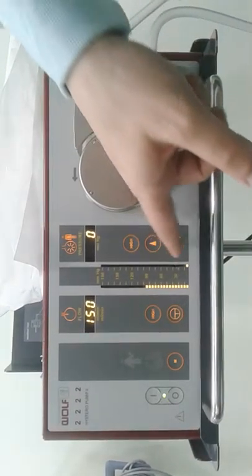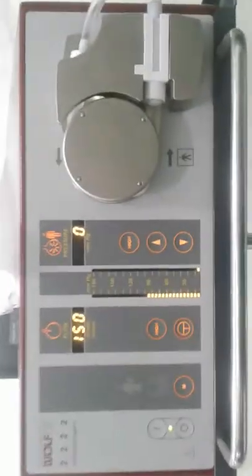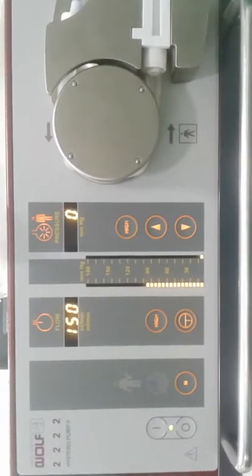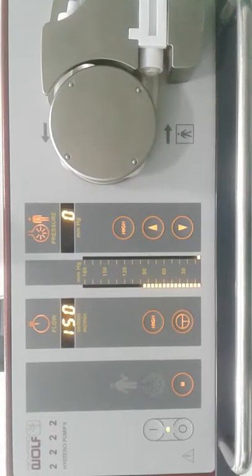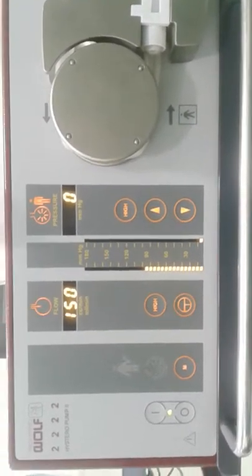So during the procedure, it will switch? Right now it can also switch. During the procedure, because there is no actual pressure now, it will show zero. Or the other one, nominal pressure.